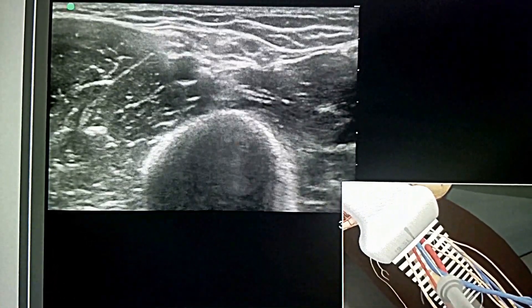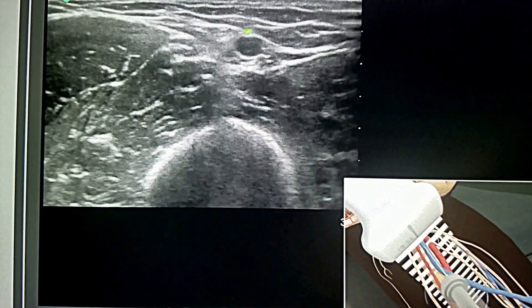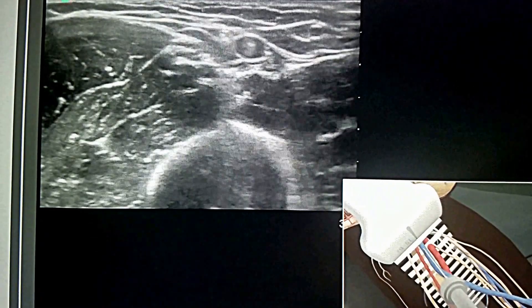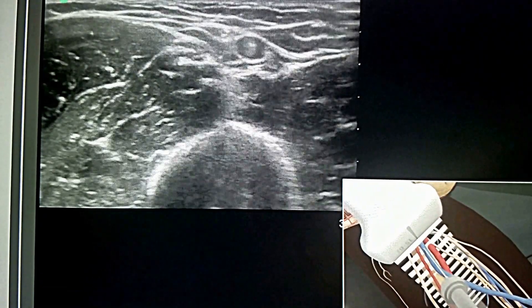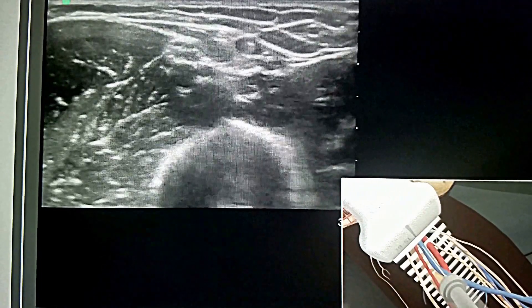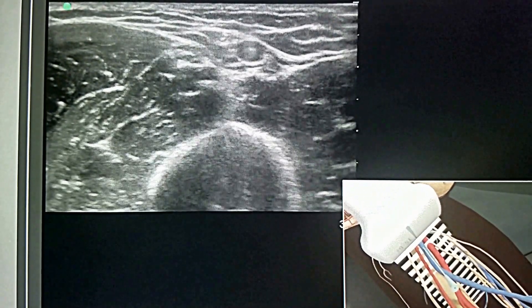The needle is slowly advanced under direct ultrasound visualization until the tip is seen to indent and then puncture the basilic vein. The transducer should be moved slightly proximally and distally to confirm that the needle tip lies in the mid-portion of the basilic vein. This technique can also be used with the deep brachial or cephalic vein.